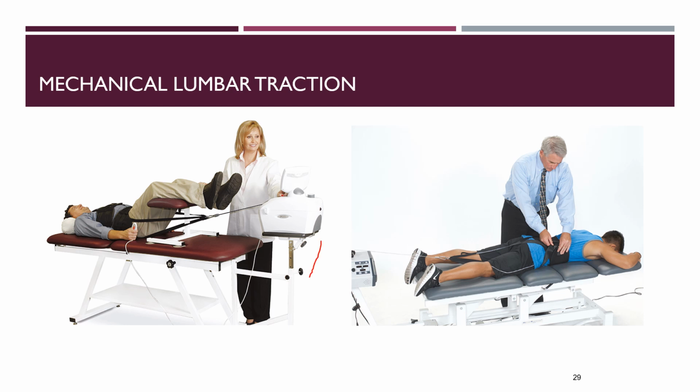So this is more like the traction unit that we have in our lab. If we're looking at this patient, they're supine, they have the belts around their hips and around their rib cage, and their legs are at about 45, a little bit higher than that. Remember that the higher the legs are here, the higher up in the lumbar spine we're targeting. So we're thinking this is probably the L3, L2, L1 area.